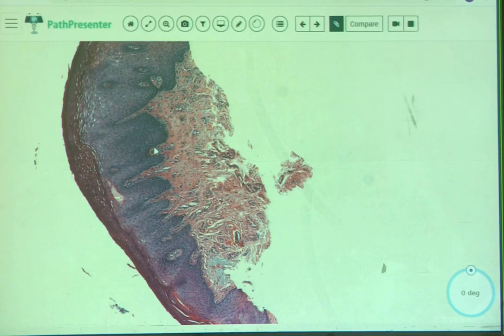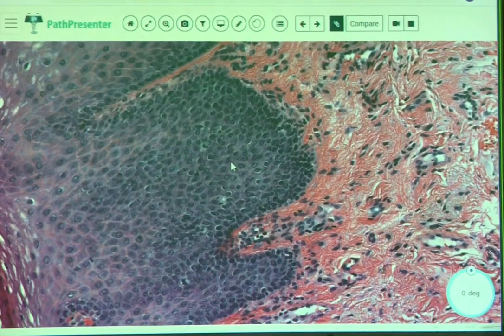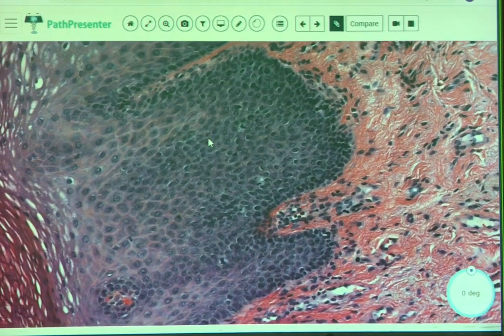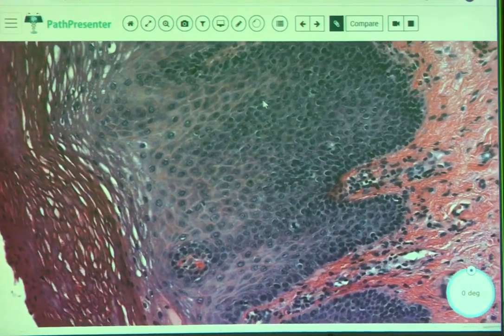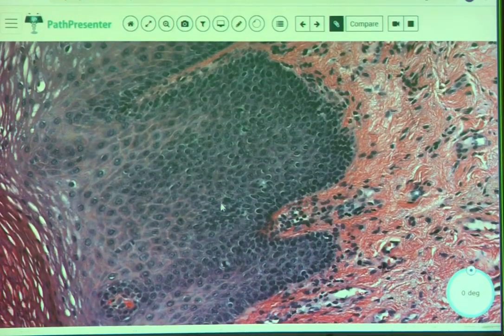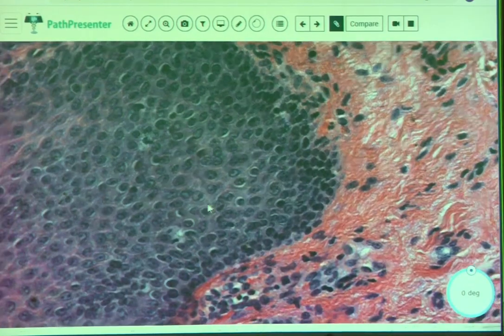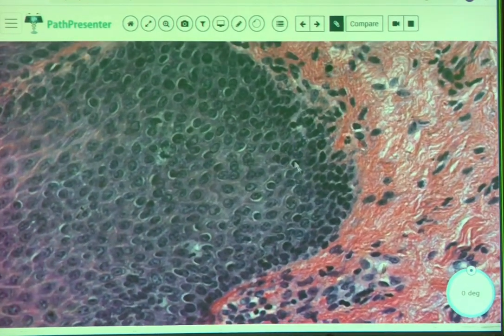Is this acanthosis? This is acanthosis, yes. It looks very thick. Mm-hmm, yeah. So the epidermis is still bigger than normal. Part of this might be too, sometimes you get tissue where it's cut at an angle. And I say that because of what we're seeing with it. Well, the basilar layer area looks kind of expanded, but I don't think... Yes, it is. Totally is.